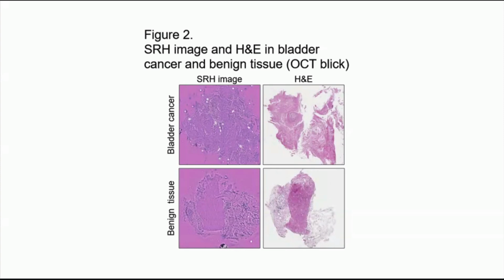Raising the question, once they start integrating the use of AI to analyze these images, could you potentially have a very fast point of care assessment, essentially a pathologic diagnosis at the time of TURBT about whether something is muscle invasive or invasive into lamina propria? Could you tell with definitive confidence that you have muscle in that specimen? Could you reduce the rate of repeat TURBTs? Kind of similar questions as to OCT, but now you actually have proper images with histology or histology equivalent rather than just the image that you take from a probe.